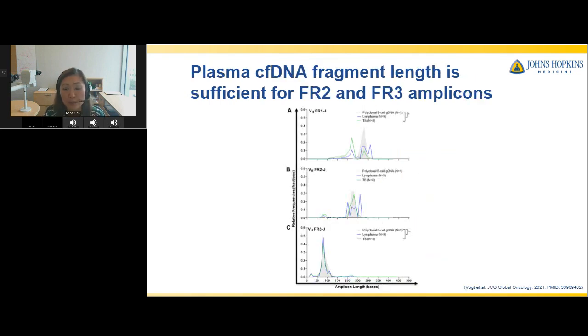Now, another tissue type or source that is very challenging for IG sequencing is plasma cell-free DNA. There is a growing literature in the past few years suggesting IG sequencing is a sensitive marker for treatment response monitoring, i.e. minimal residual disease monitoring, in patients with aggressive B-cell lymphomas. These lymphomas form masses, they don't circulate, so it's actually very difficult to assess response. Despite the fact that plasma is a fresh whole blood derived specimen, plasma DNA is highly fragmented.